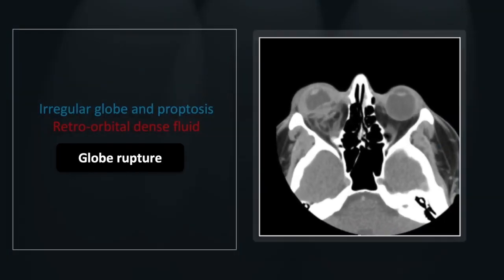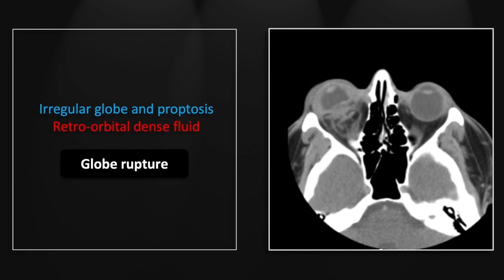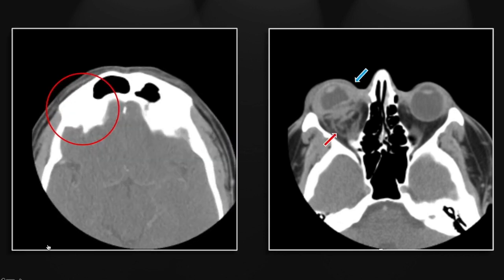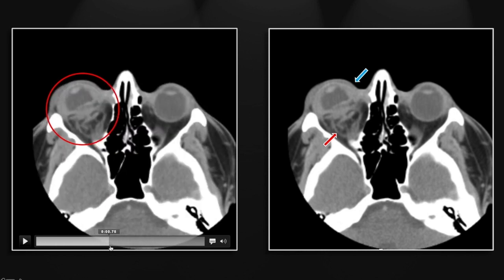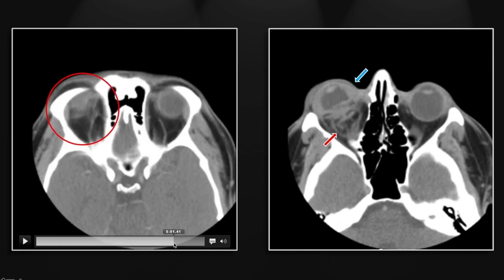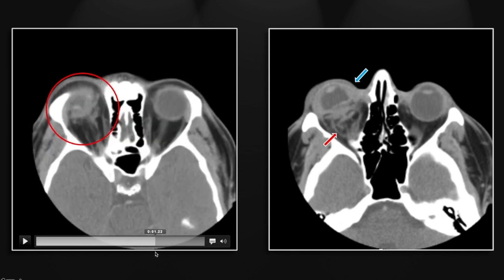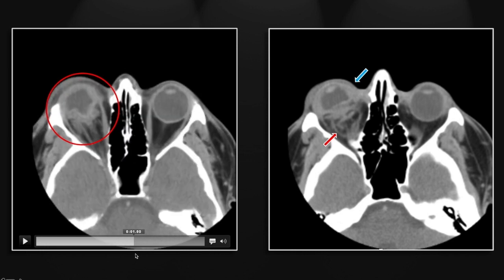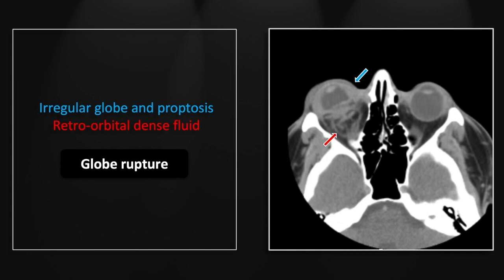The next case is a globe rupture, a more straightforward one due to a direct blow. You can see the abnormal irregular contour of the globe, especially posteriorly. There is significant proptosis due to the retrobulbar hemorrhage — those wispy densities in the retrobulbar fat. Note the stretching of the optic nerve consistent with proptosis. That is a case of globe rupture.